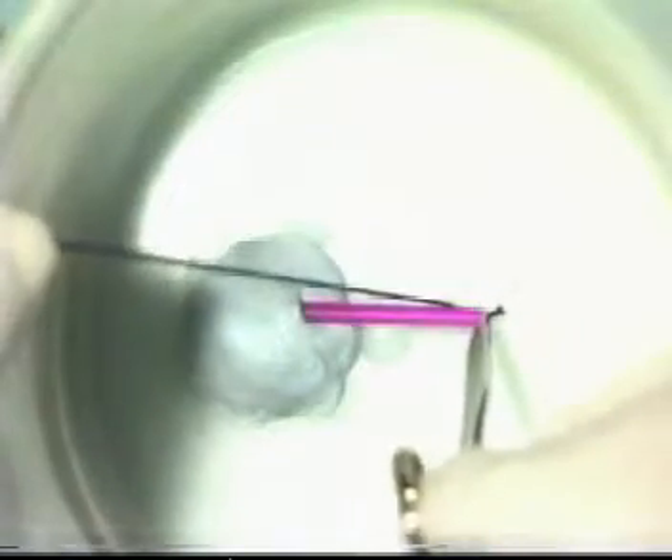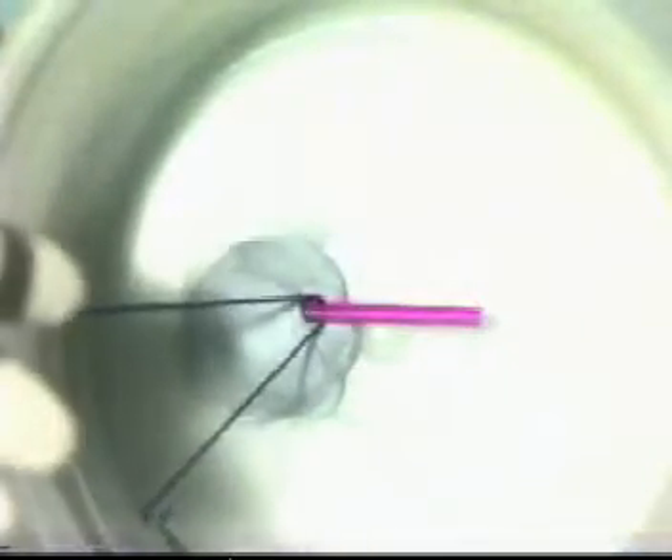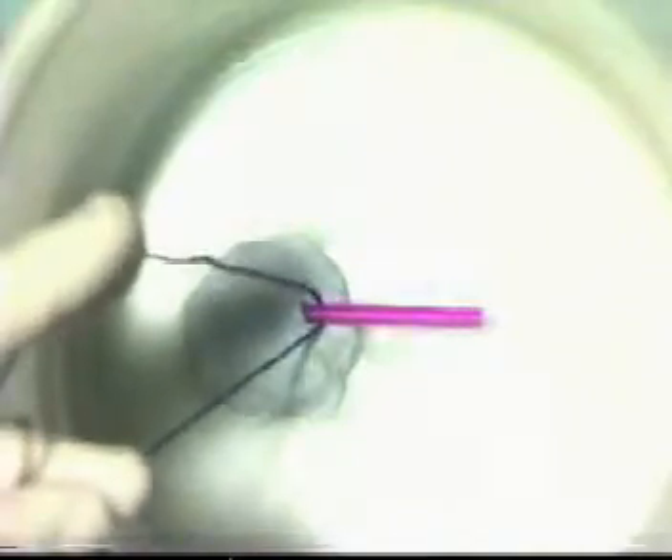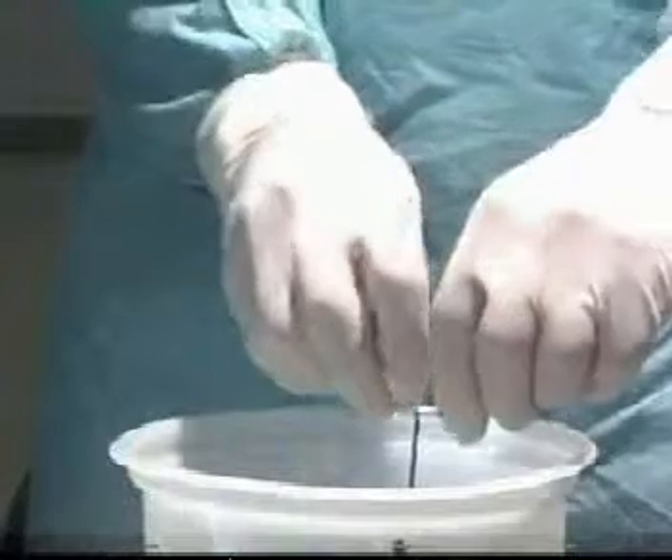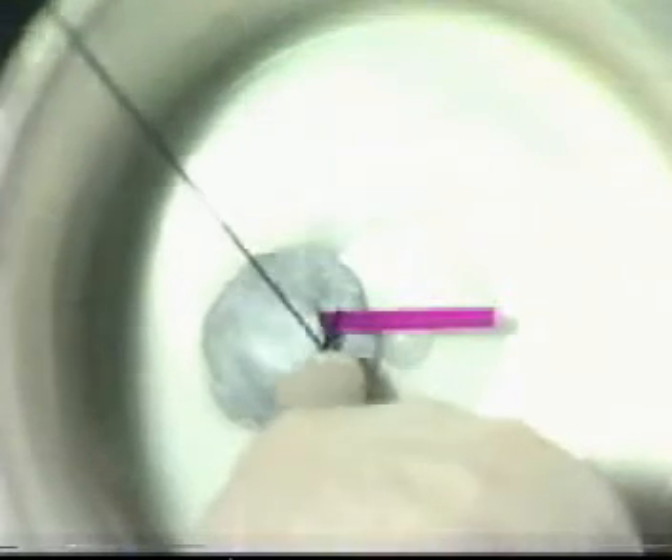Take your suture material in the tip of a hemostat and pass it round the blood vessel, taking great care not to exert any tension. Bring the suture material out of the pelvis, tie and snug that down using the index finger.